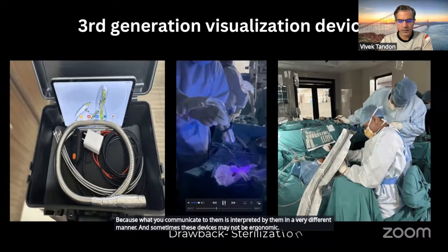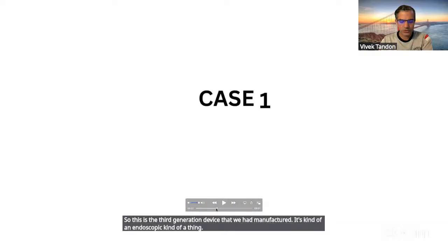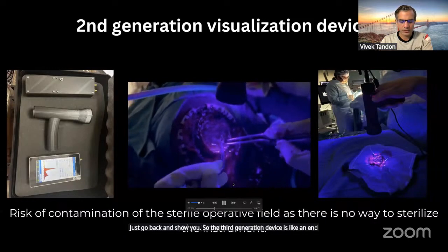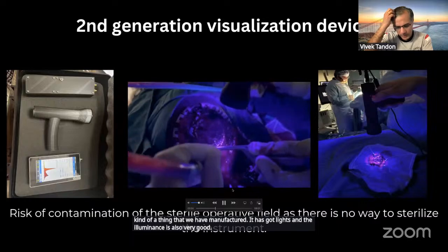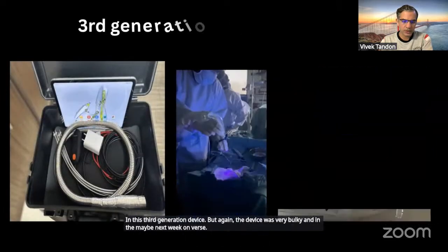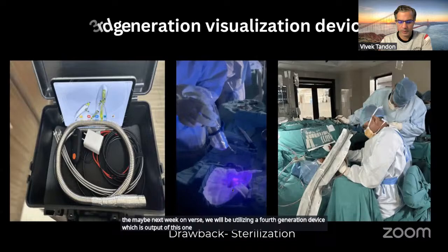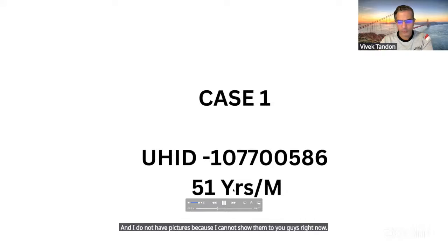So this is the third generation device that we had manufactured. It's kind of an endoscopic kind of thing. I'll just go back and show you. So the third generation device is like an endoscope that we have manufactured. It has got lights, and the illuminance is also very good in this third generation device. But again, the device was very bulky, and maybe from next week onwards, we will be utilizing a fourth generation device, which is the output of this one that you are seeing here in the picture. I do not have pictures because I cannot show them to you right now. We have to meet again this week and finalize the design, and maybe by next week we will be able to use that.